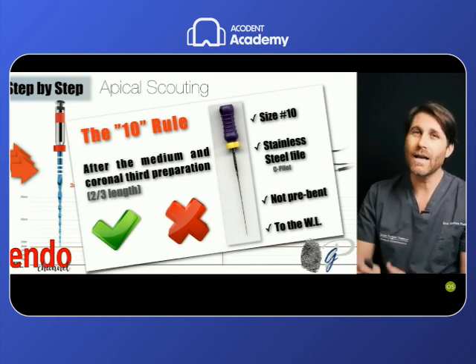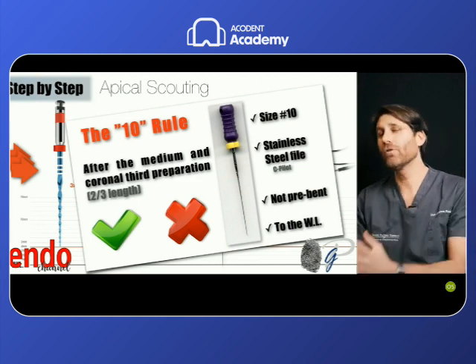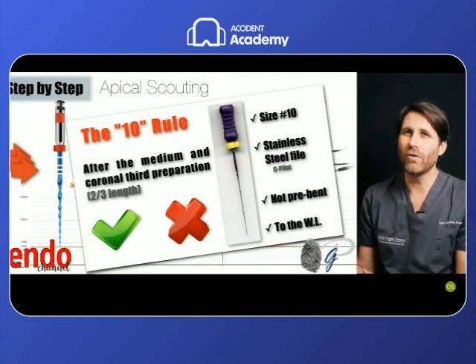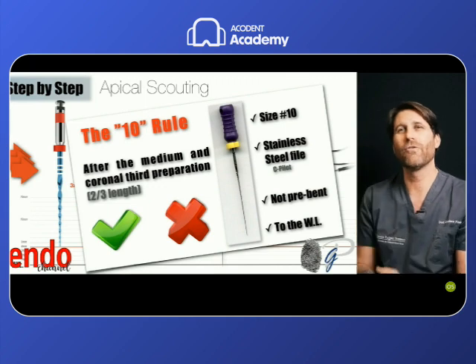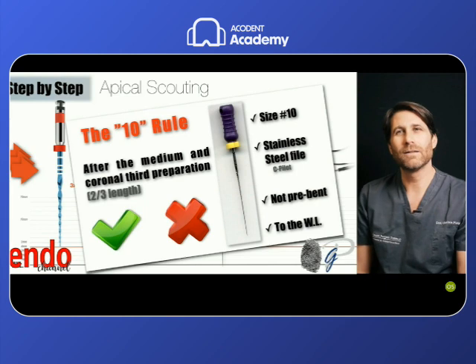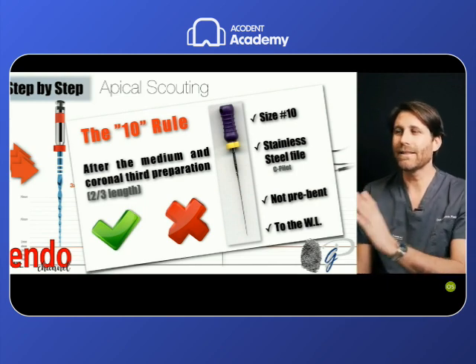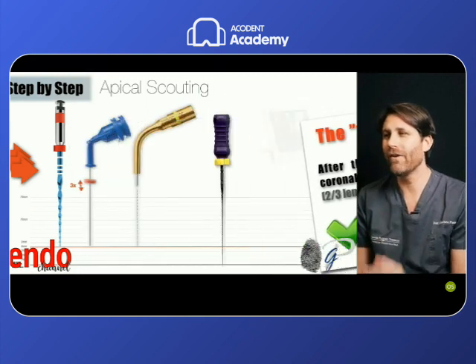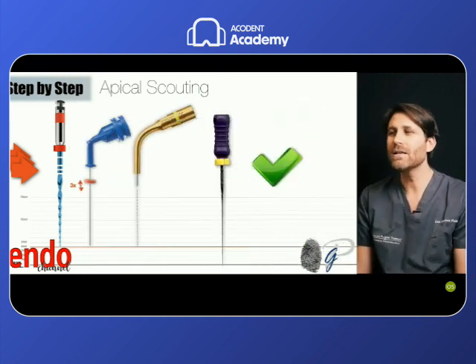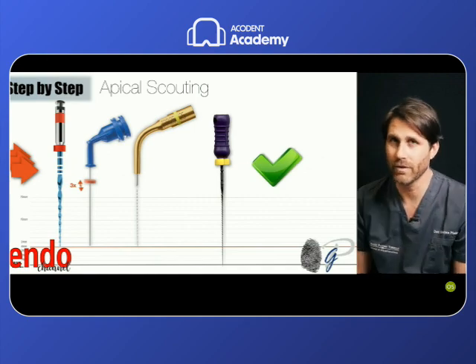So in these canals in which we have a coronal difficulty to the scouting, in most of the cases we have solved it. In some small percentage of cases, the apical difficulty to scouting is summing to the coronal difficulty of scouting. But in most of the cases, a 10 stainless steel file reaches the working length, so then we can complete the preparation with the same instrument.